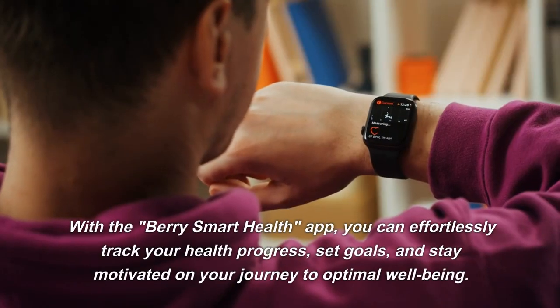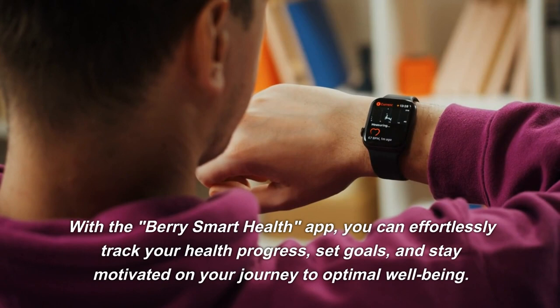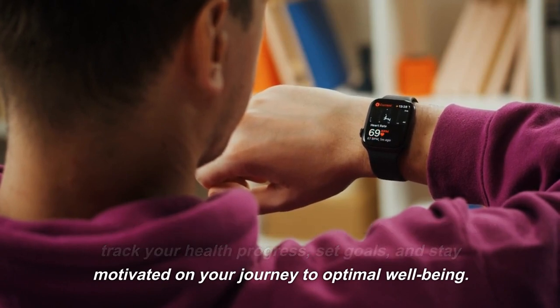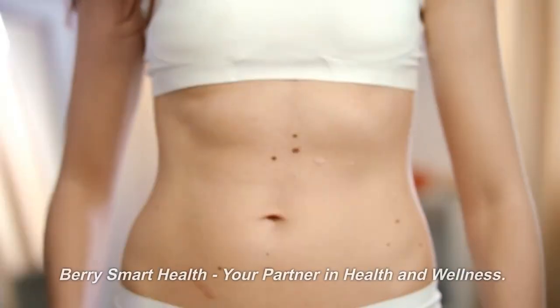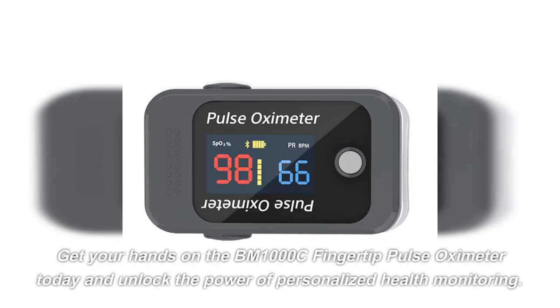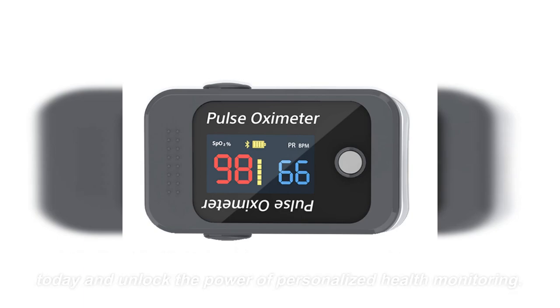With the BerrySmartHealth app, you can effortlessly track your health progress, set goals, and stay motivated on your journey to optimal well-being. BerrySmartHealth — your partner in health and wellness. Get your hands on the BM1000C fingertip pulse oximeter today and unlock the power of personalized health monitoring.